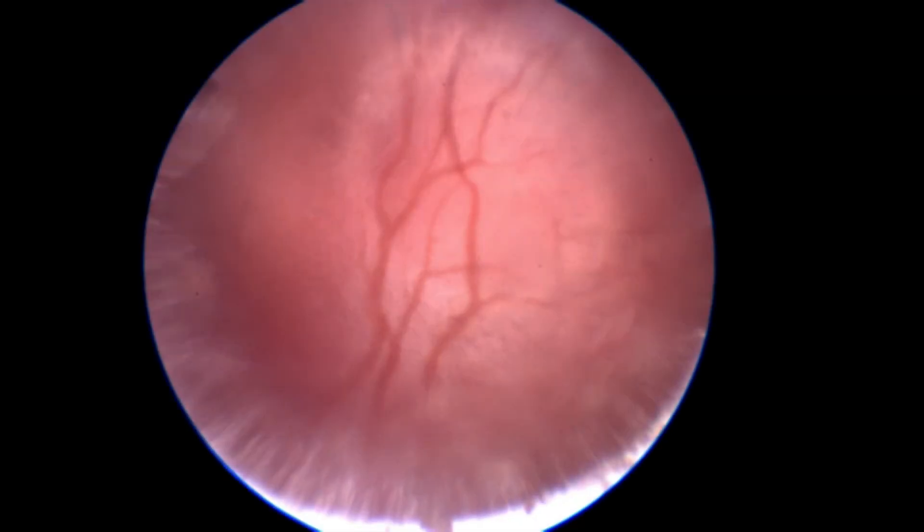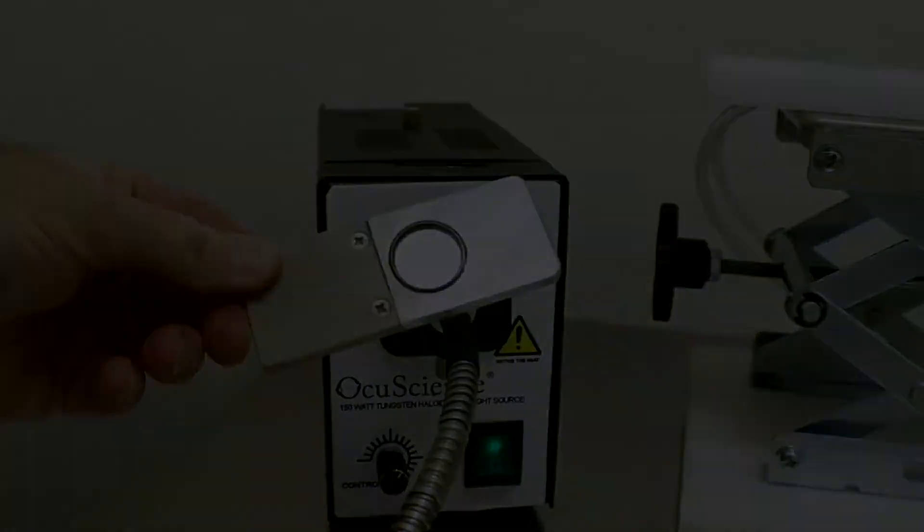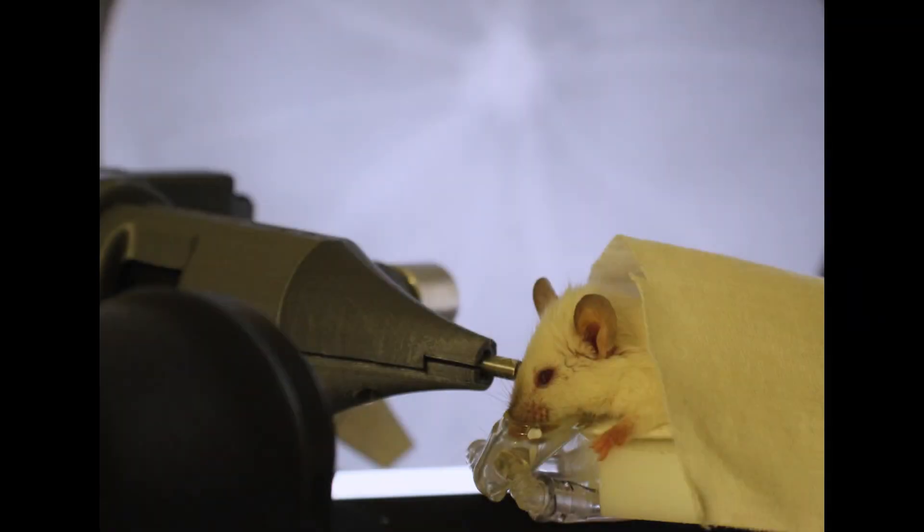Back to the fundascope now, which includes dynamic imaging capabilities by adding various excitation and emission filters, like this one, to both the light source and the fundascope. These filter slides allow the user to image nearly an infinite number of fluorescent targets as well as angiography.